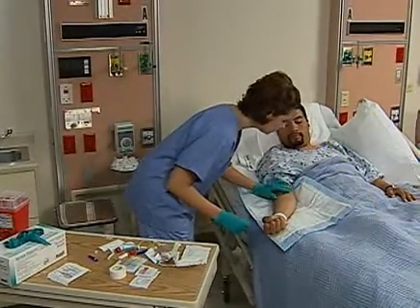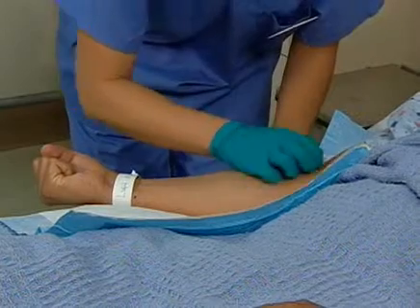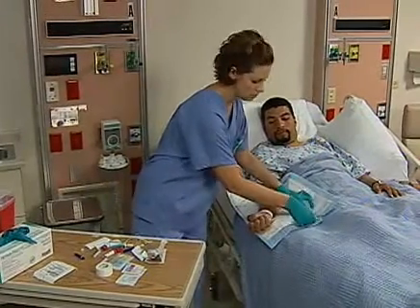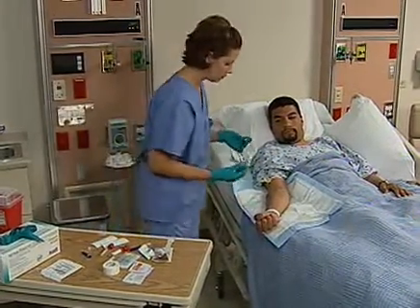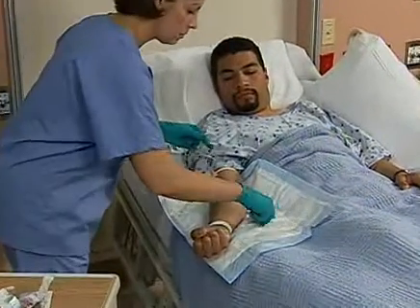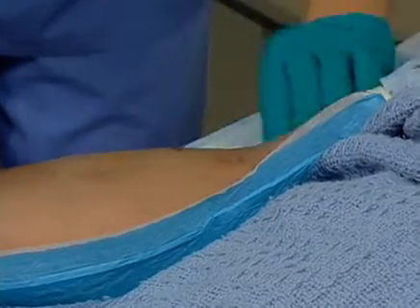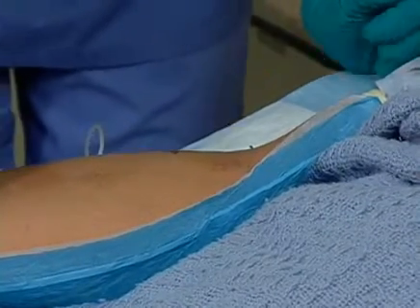Lightly tap the vein you have chosen. Next, you will want to clean the site. Place the thumb of your non-dominant hand over the vein to be punctured and retract the skin away from the direction of the needle insertion. Retract the skin near the venipuncture site so the skin is taut.